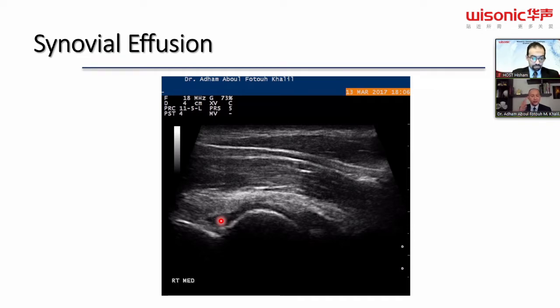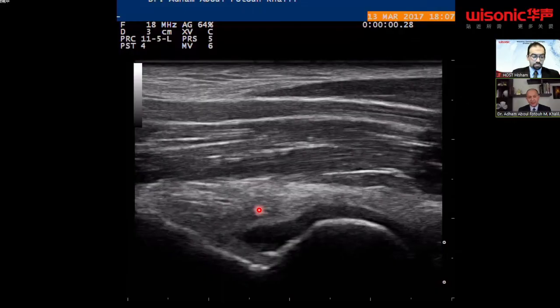If you are not perpendicular to the structure, like tendon, like capsules, like even fat pads, and some nerves, you will see anisotropy. You need to be perpendicular. All these soft tissue components just differ in the degree of showing the anisotropy, but eventually every one will show it.